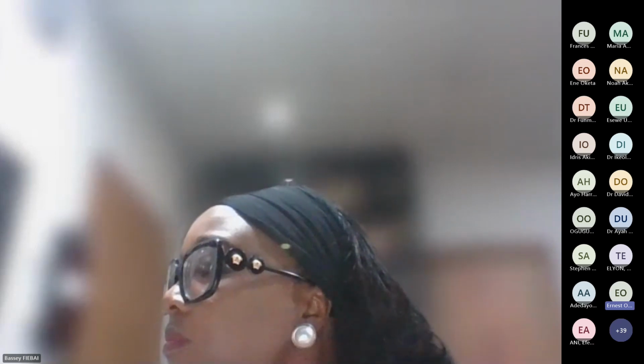This is also very important in doing cataract surgery. If you can't see the depth, like in most cataracts that we have, you must ensure that a B-scan is done, because hiding behind the cataract you may have vitreous hemorrhage, or even retinal detachment or other pathologies. You do a beautiful cataract surgery, and the next day the patient is not seeing. And you wouldn't know whether you are the one that induced the RD or it was pre-existing.